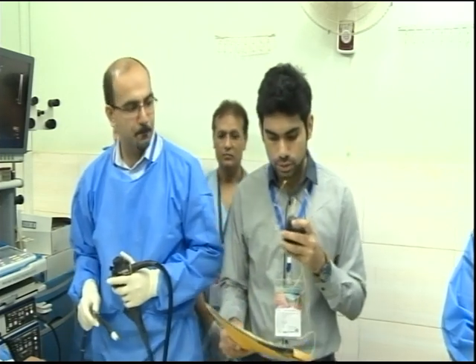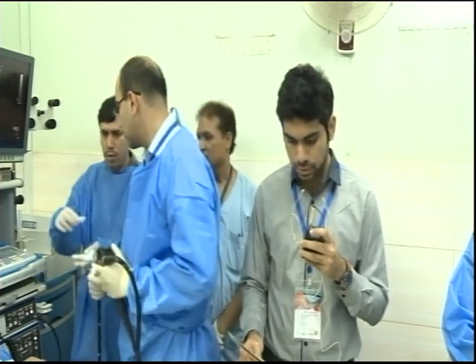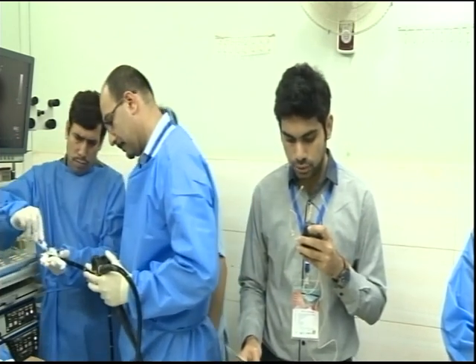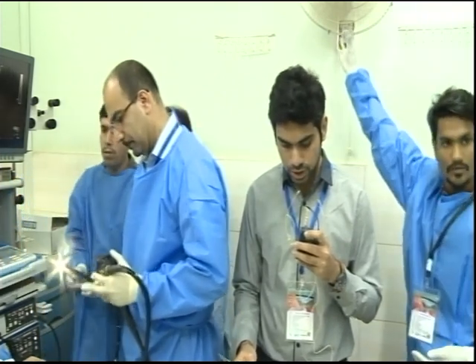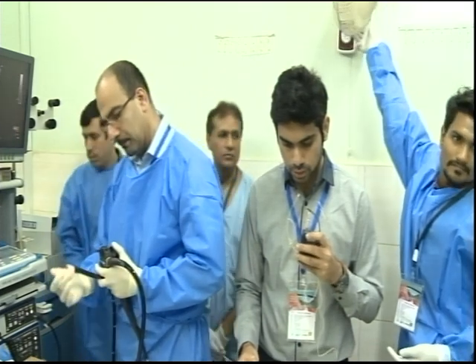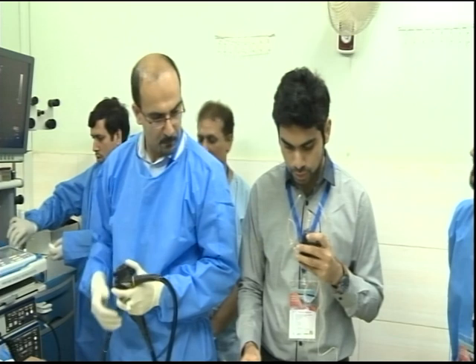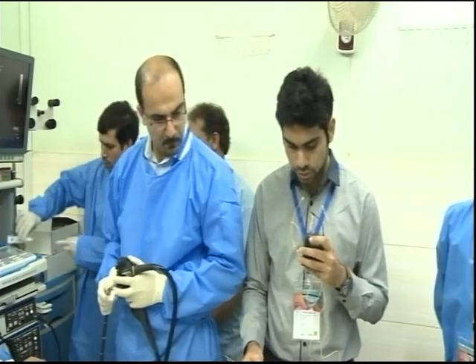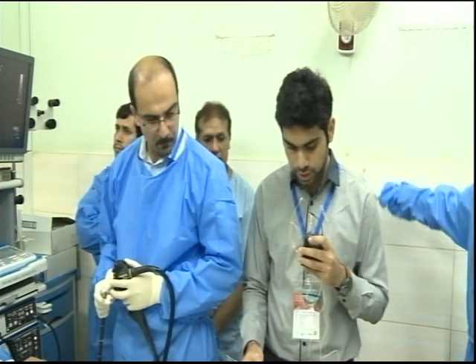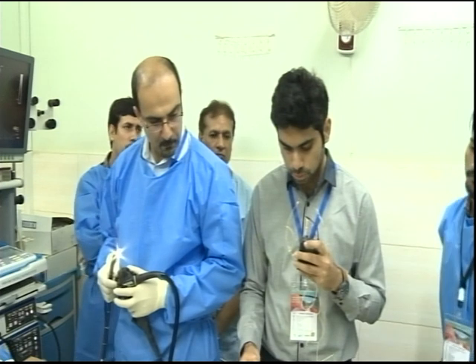Yeah, okay. So, this is a case of a 17-year-old male patient presented with complaint of recurrent abdominal pain for the past 6 to 7 months, on and off. His investigation, CT scan abdomen done on 26th January this year, shows a significantly dilated pancreatic duct filled with proteinaceous content and associated parenchymal atrophy. Findings are suggestive of intraductal papillary mucinous neoplasm.